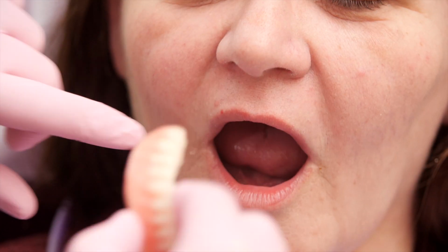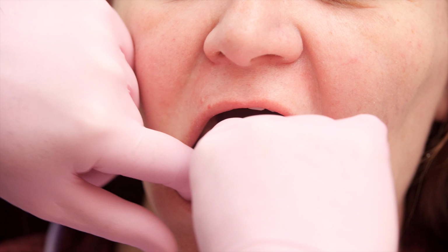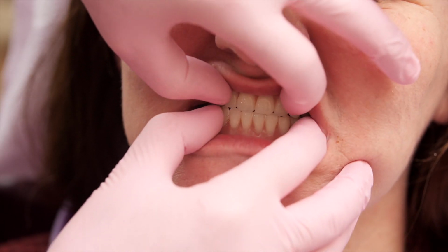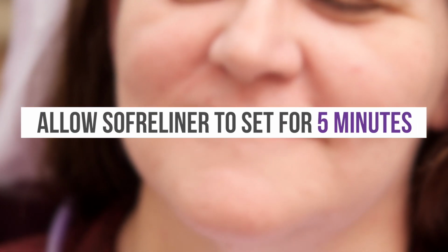Here we're delivering the lower denture intraorally by placing it against the ridge and applying some pressure, but most of the pressure that's going to be applied is from the patient's occlusion itself. The lower denture will be allowed to set intraorally for the recommended 5-minute setting time.